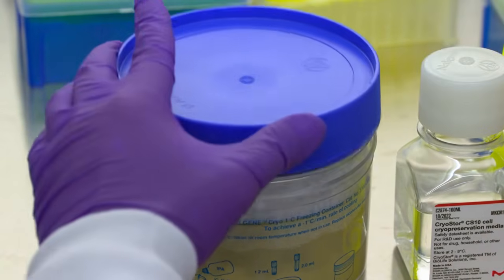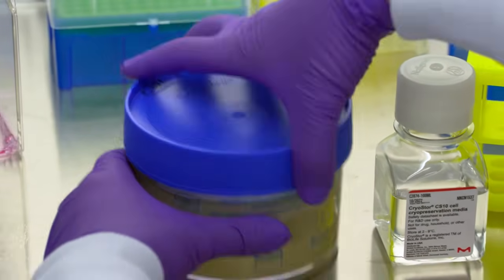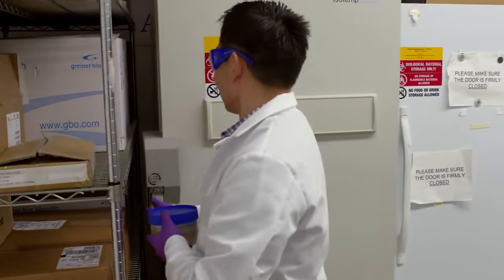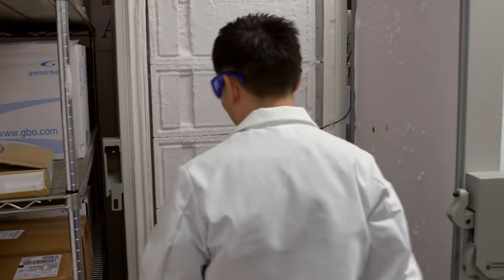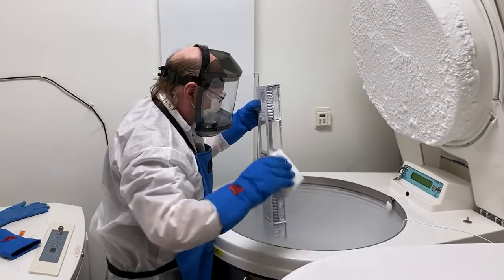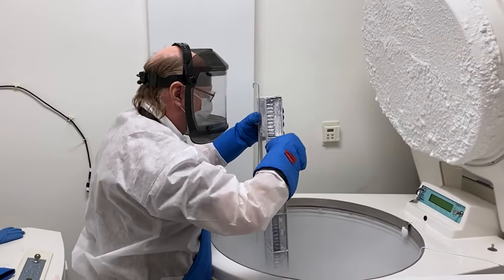Transfer tubes to the freezing container and place the device in a -80 degrees Celsius freezer overnight. Next day, quickly transfer cells into liquid nitrogen for permanent storage.